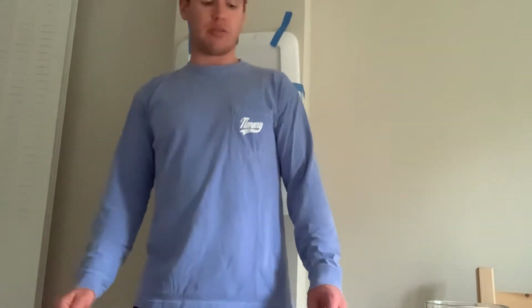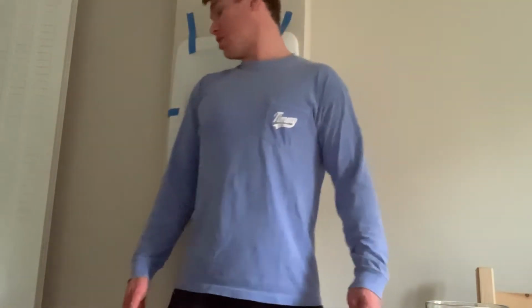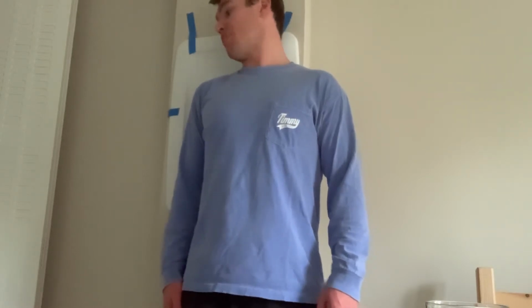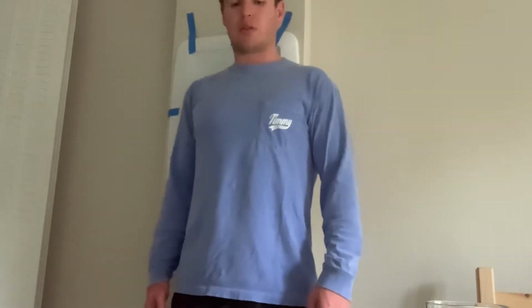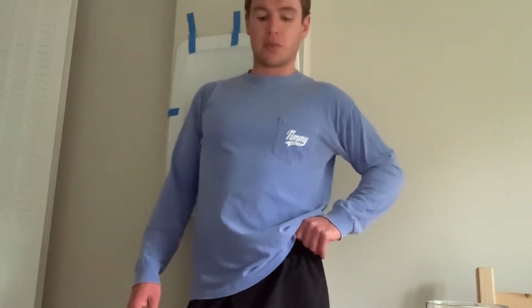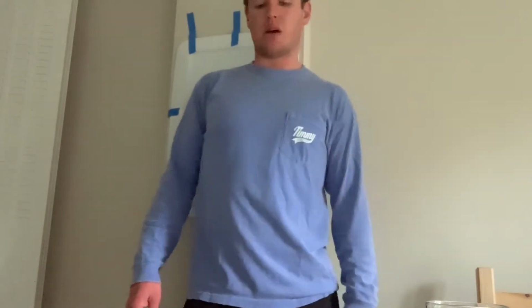These next three views are for traumatic pain, traumatic injury. So first we'll be doing the A to P neutral. So again, the patient's back will be flat against the cassette. The arm will just be rested, relaxed, with the palm resting on the thigh. Our central ray will be directed through our coracoid process again, and this will give us an A to P projection of the shoulder joint, the AC joint, and the proximal humerus, distal clavicle, and the scapula behind them.